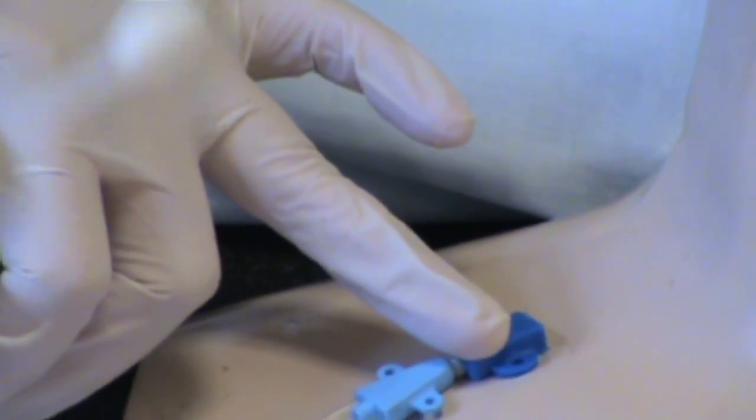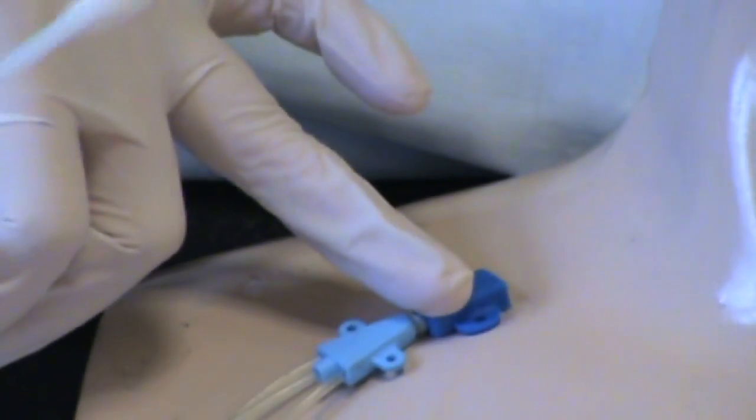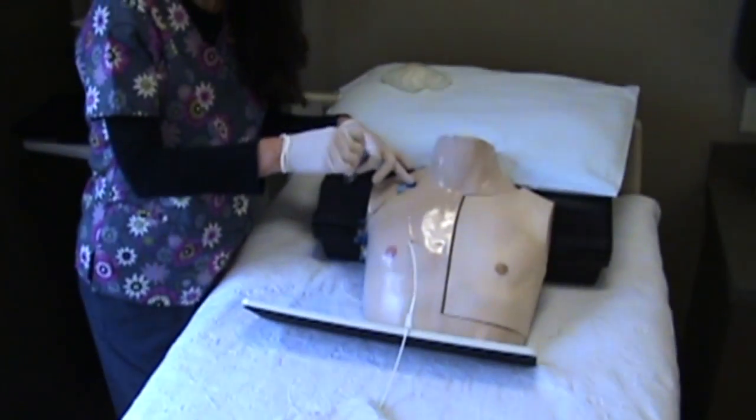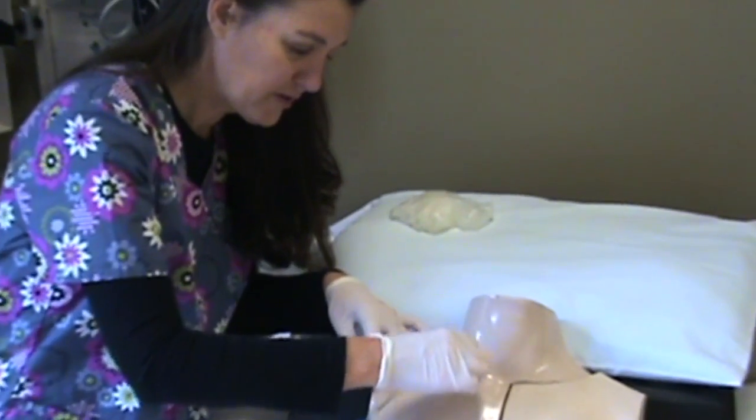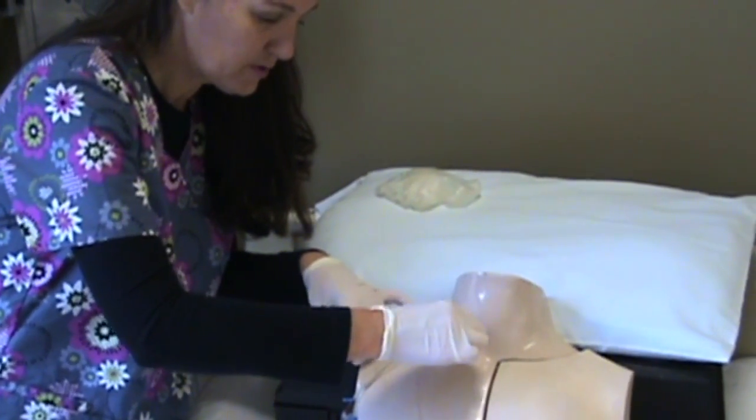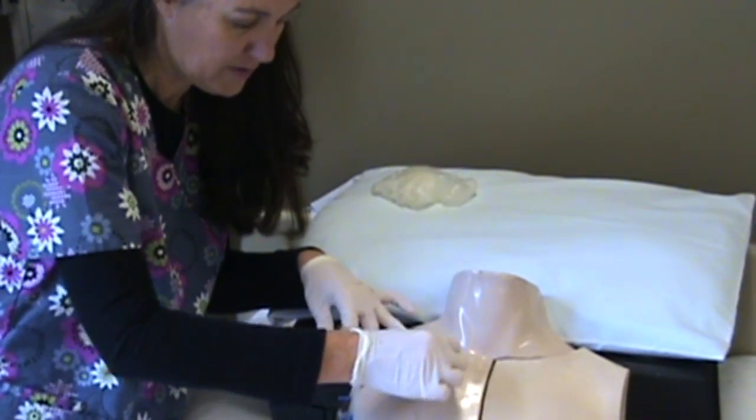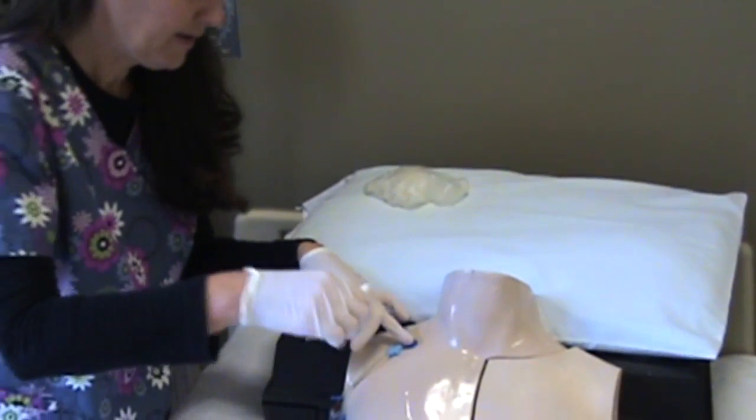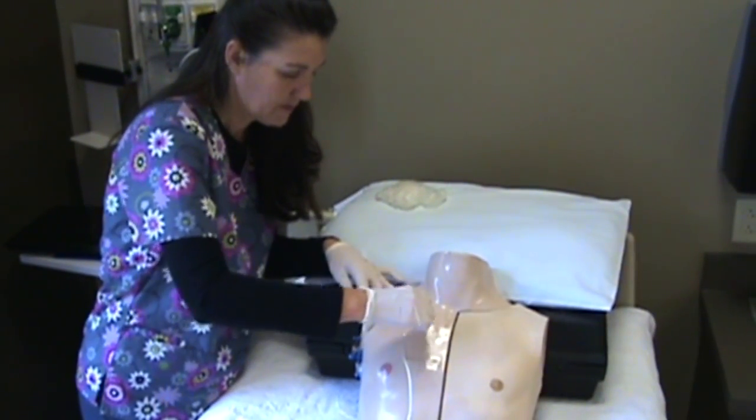Now that we've finished the first one, we're going to go around our sterile field and put it in the trash. You have two more left, so the same thing: you start at the point of entry and you swab it and rotate your swab stick all the way around. You will use all three of these swab sticks. Rotate it all the way.